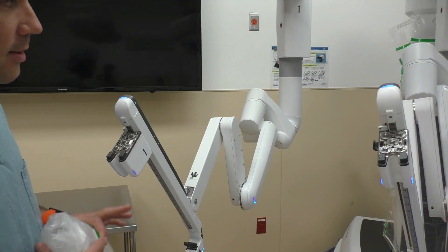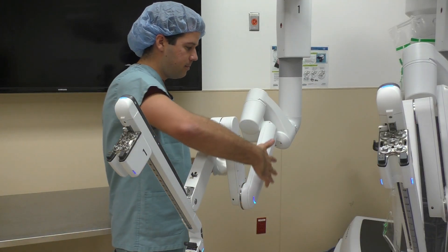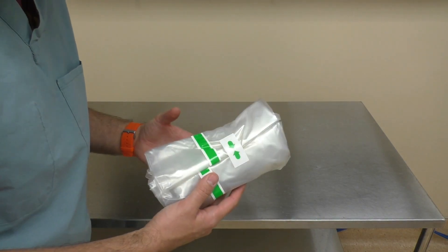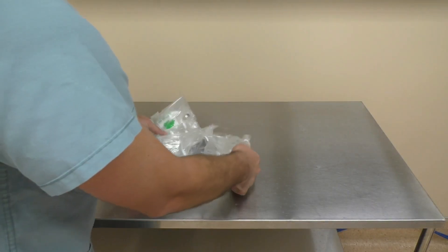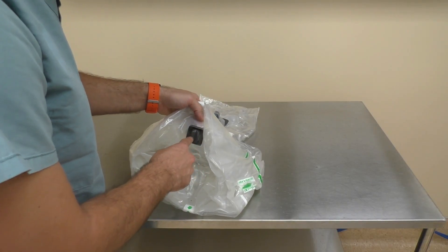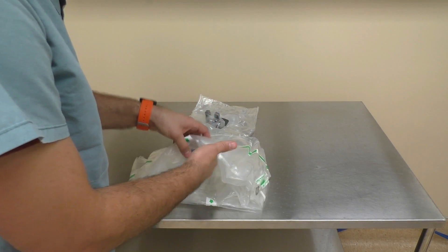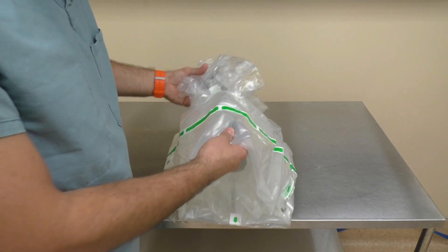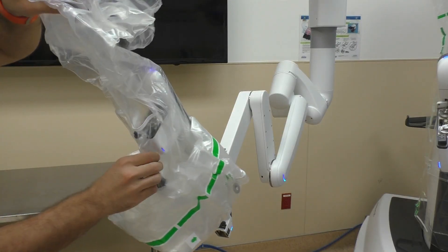Next is our arm drape. It's much easier on the Xi than it was on the Si. You're basically going to start over this arm and move up, up, up until you get to the magnets and just put them in place. This is the arm drape as you get it right out of the package on your sterile field. Pop this tape open and fold it out. You want to make sure this piece and this piece are facing forward when you drape this. I like to grab both of these plastic pieces together and go directly over the arm, starting on the outside and draping it over the arm itself.